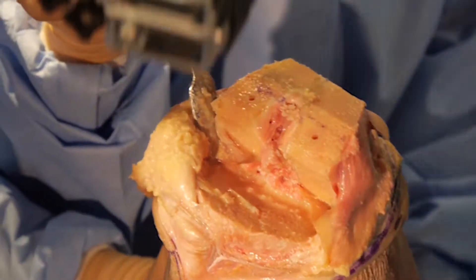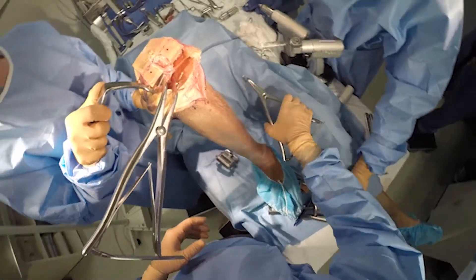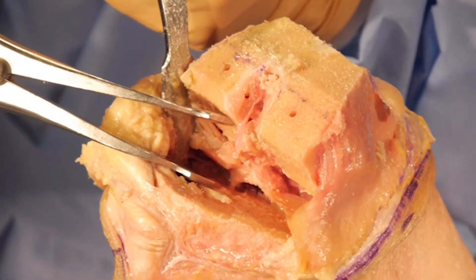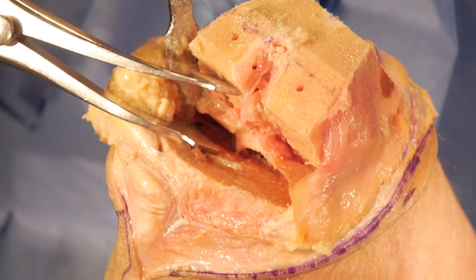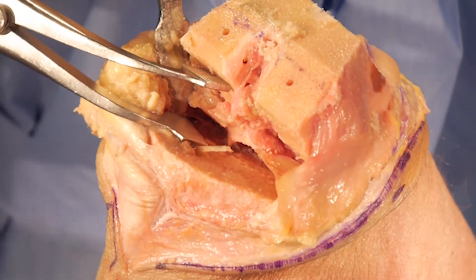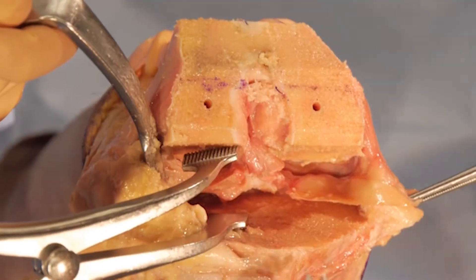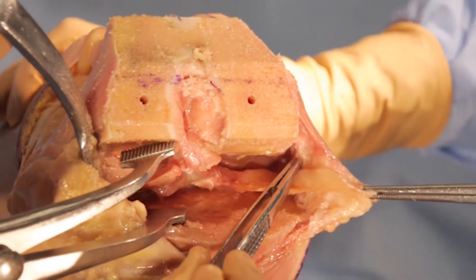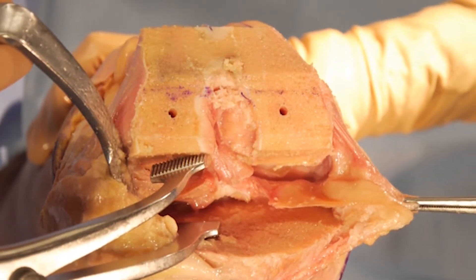I'll insert a laminar spreader on both sides to remove the meniscus. The MCL actually attaches on the medial meniscus, so as you're going around you can see where your MCL is coming in. As you're taking the medial meniscus out, keep an eye on where your MCL is inserting onto the meniscus — at that area you want to leave a millimeter or two cuff of meniscus so you don't remove the MCL. To keep the MCL in tension, you can place a clamp onto the soft tissue. By keeping soft tissues under tension, you can see the MCL very clearly as you remove the medial meniscus.